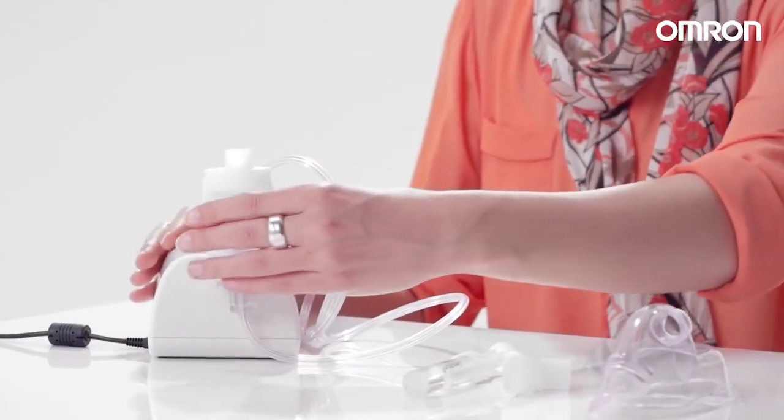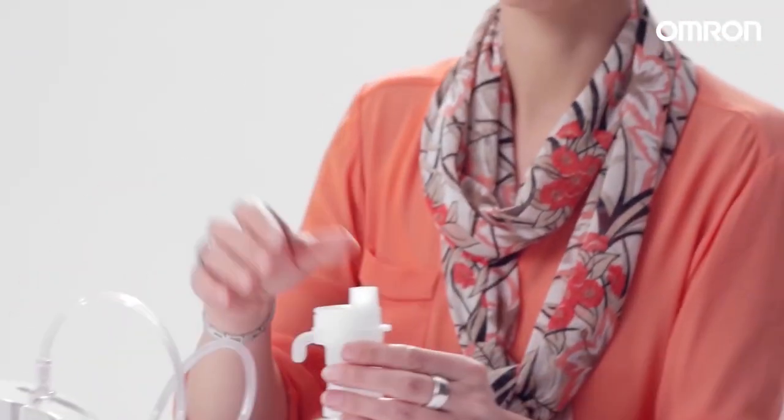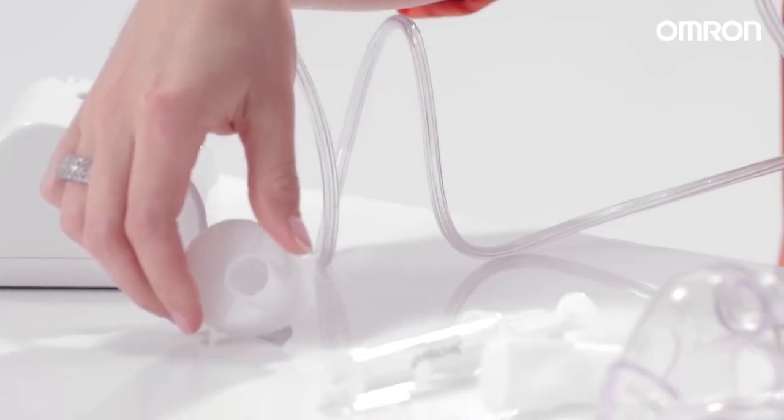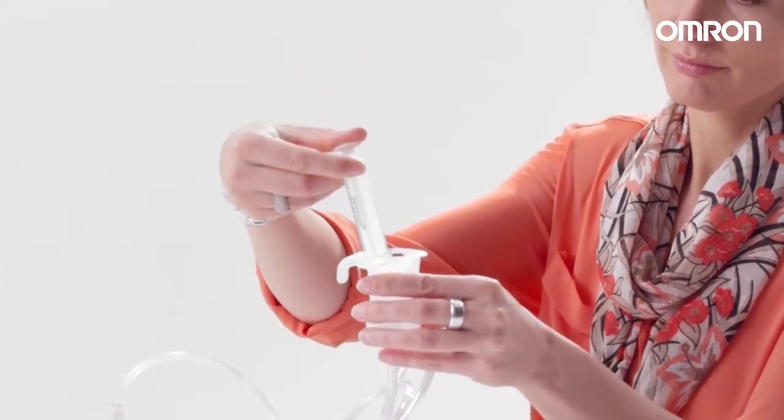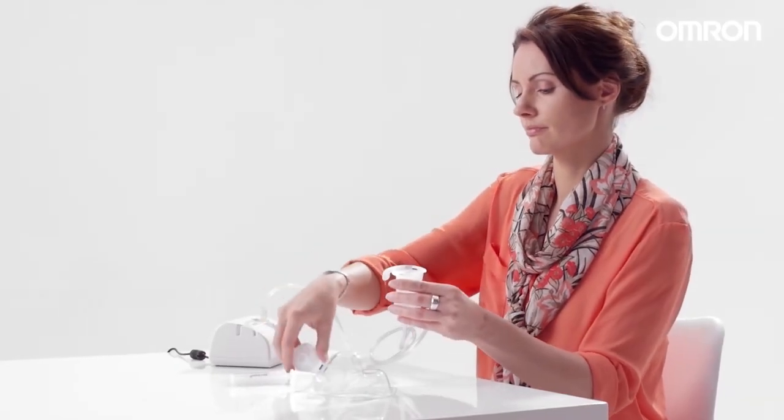Now assemble the nebulizer kit. Rotate the inhalation top counterclockwise and lift it out of the medication tank. Pour the correct amount of prescribed medication into the medication tank and replace the inhalation top.